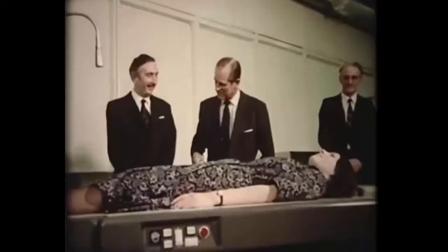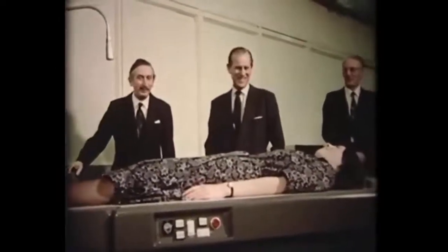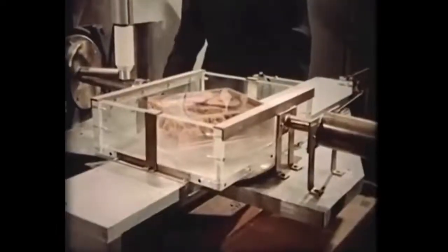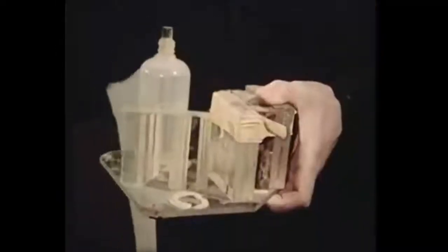He's an EMI scientist looking for new areas where computers could be of benefit. Where better than X-rays, still producing Röntgen's vague shadowgrams. Tests begin on a rig built from an old lathe. X-ray data is fed into a computer. Would it show up density differences in animal tissues as well as it does on the Perspex model?